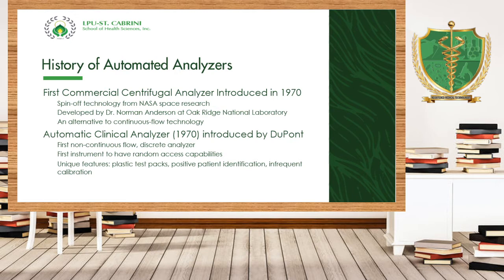Now, remember also, guys, that the automatic clinical analyzer was the first analyzer that is capable of stat analysis. Like what we have said in the first three equipment or analyzers, they can run 40 samples per hour, 300 to 700 samples per hour, simultaneously 6 to 12 tests for the second generation.